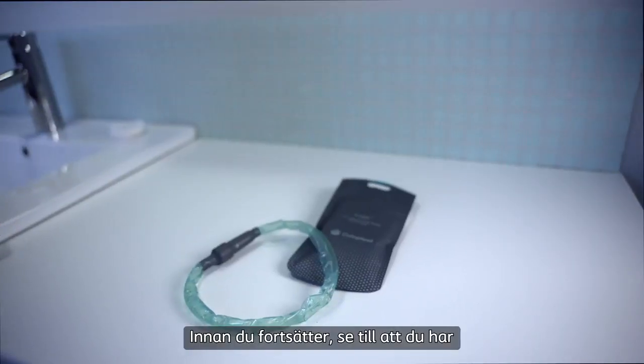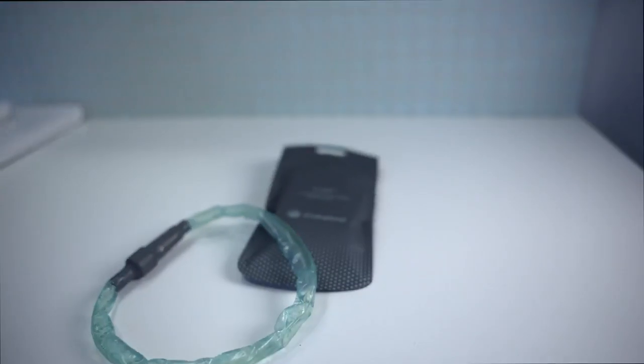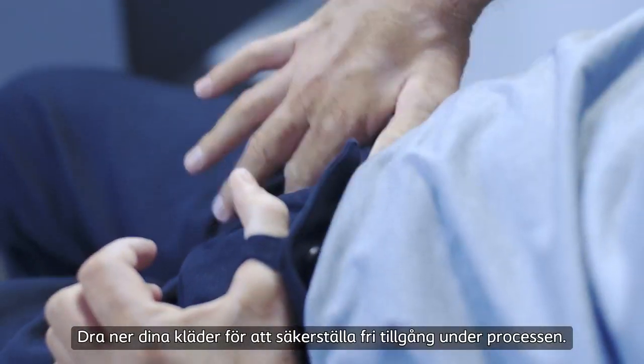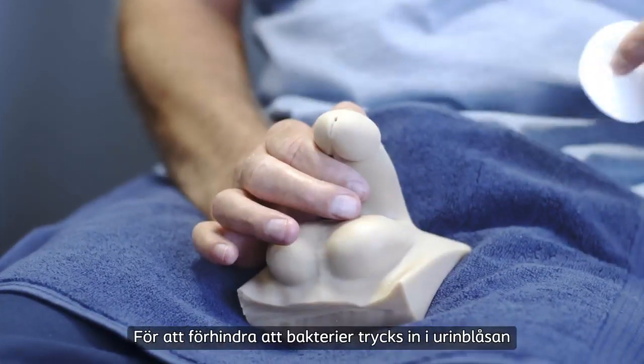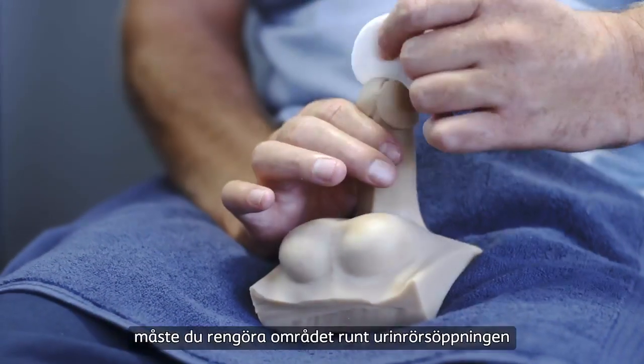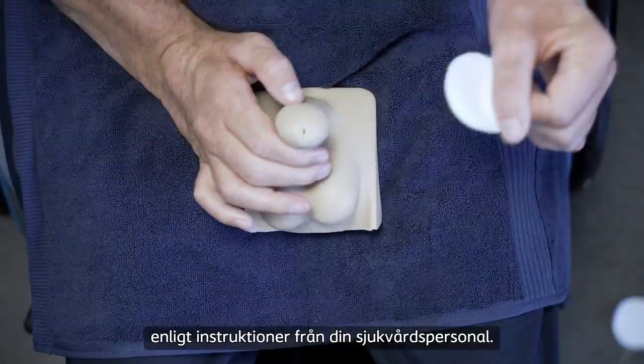Before you proceed, make sure you have all the equipment ready that you will need for the catheterization. Pull down your clothes to ensure free access during the process. To prevent pushing bacteria into the bladder when you catheterize, you must clean the area around the urethral opening as instructed by your healthcare professional.